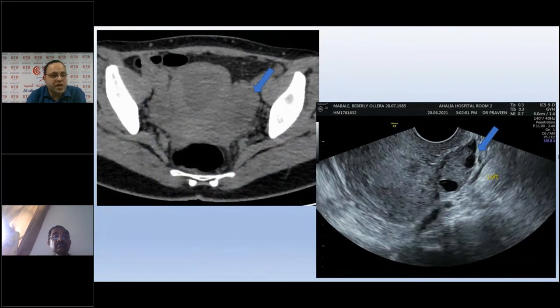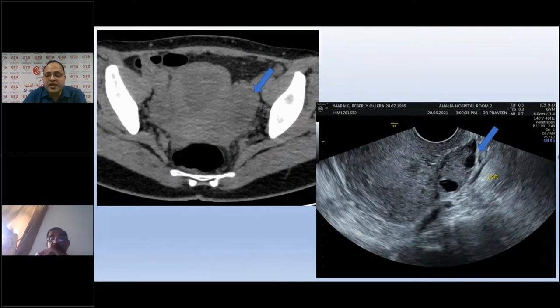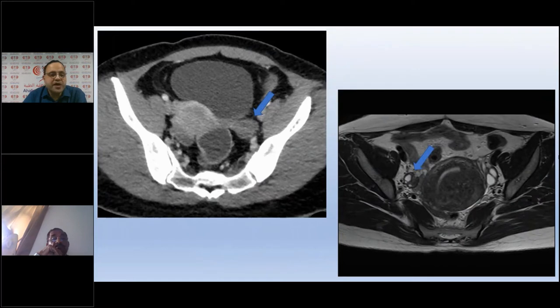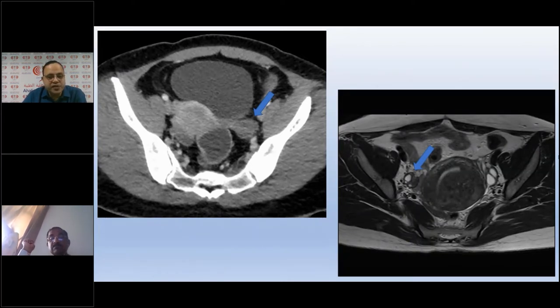For ovary identification, on plain CT the ovary appears as simple soft tissue — we cannot differentiate stroma from follicles, and it may be hard to separate from normal bowel. Ultrasound clearly shows the stroma-follicle difference. Even with contrast CT, ovarian characterization remains limited, whereas T2-weighted MRI clearly demonstrates ovarian stroma and follicles. This illustrates the superior soft tissue contrast of ultrasound and MRI compared to CT.